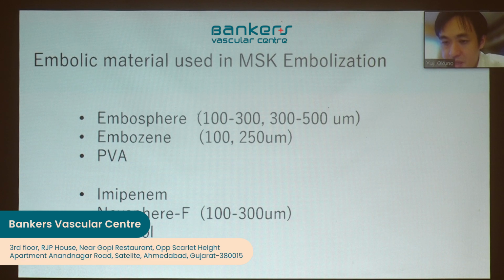The lower ones are temporary embolic materials. Imipenem, which I just introduced, and the next sphere is made by a sphere type, and Lipiodol. Lipiodol is a liquid embolic material, among others. Basically, the permanent microsphere has side effects like cutaneous skin damage, nerve damage, and strong pain after embolization. So we recommend you start with a temporary embolic material.